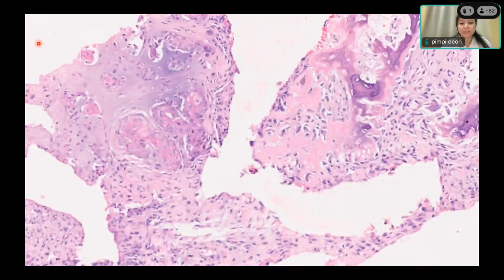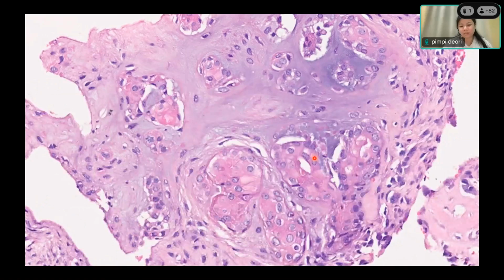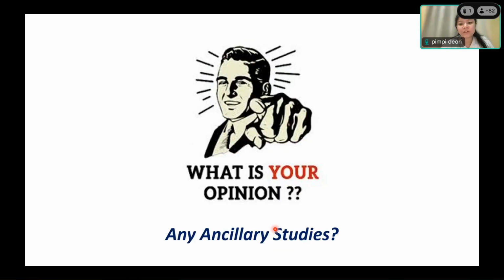Ma'am, it is a tumor which has replaced the whole normal breast tissue with a biphasic pattern of epithelial and mesenchymal components. Tumor cells are arranged in solid sheets, nests, or fascicles, and osteoid and chondromyxoid areas are also seen.